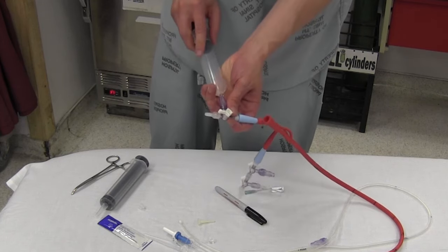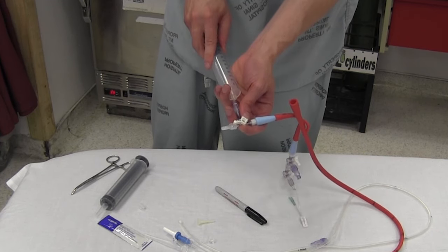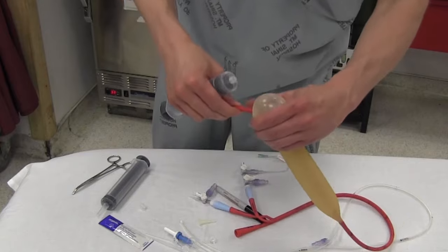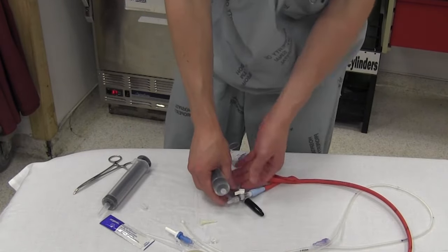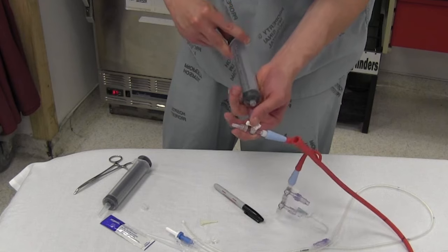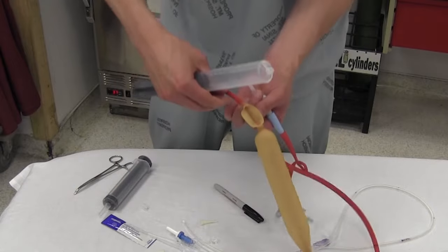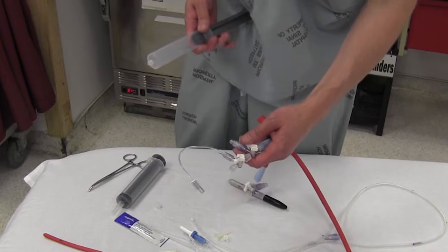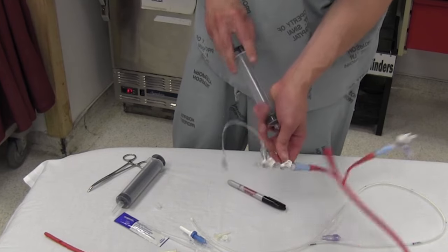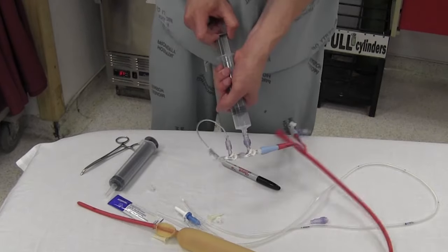Now we can test the gastric balloon by putting in 250cc's of air. You want to make sure the balloon is not leaking. Then fully deflate that gastric port to the point where it's totally involuted. Then we'll test out the esophageal balloon — this one only needs about 70cc's of air total, so we'll test it with about 80 or 90. Looks good. Now fully deflate that one as well.